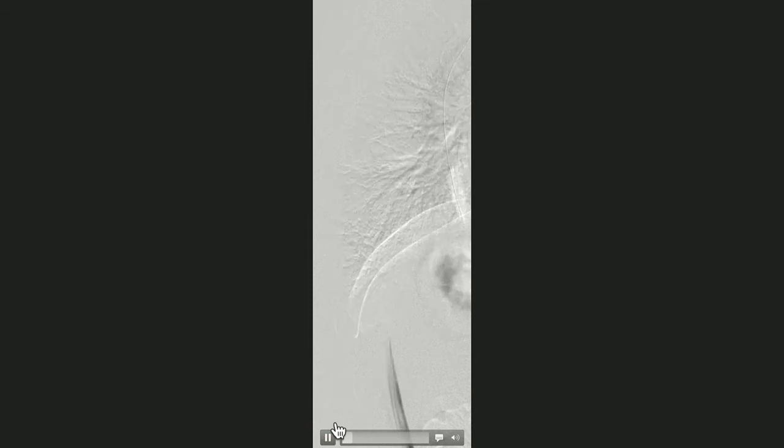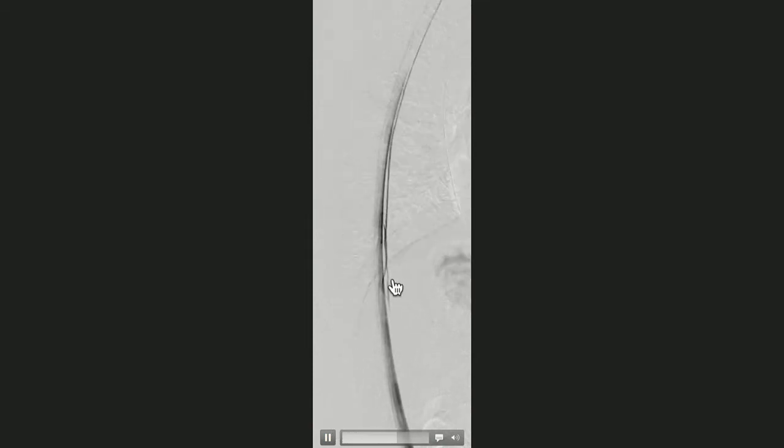Let me show you an example where DSM, digital subtraction, really shines, and that's with ventral leaks. This patient had a known from MRI a ventral leak, and this is a lateral view. Again, this is done under anesthesia with the patient's respiration suspended for about 30-40 seconds for the duration of the injection. And as you can see, the ventral aspect of the sac, there's a communication with the extrathecal collection.